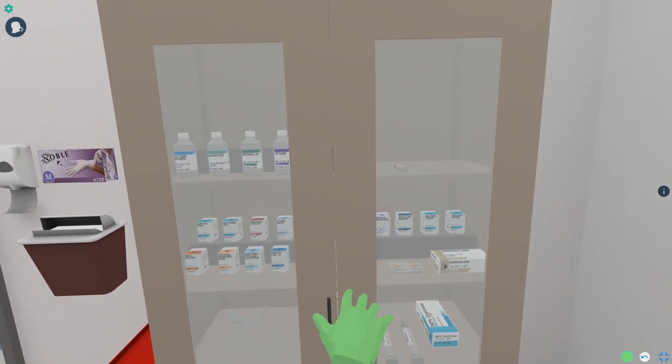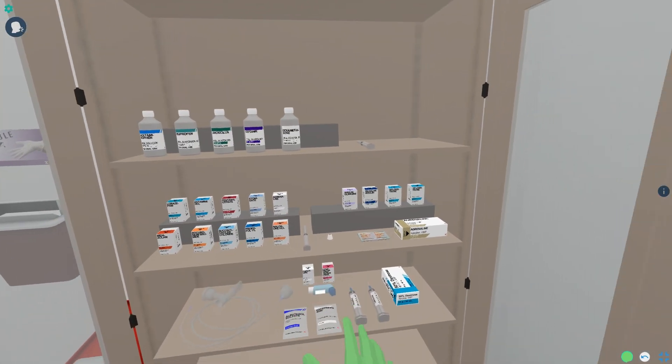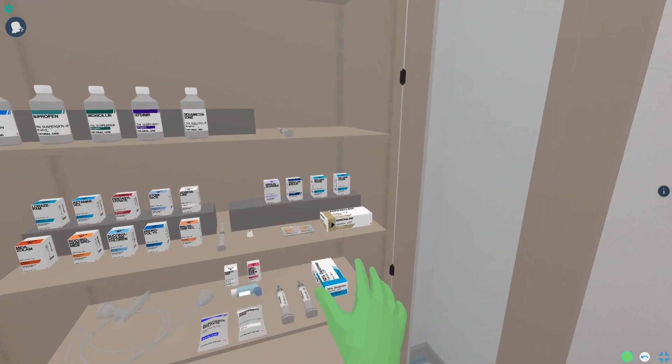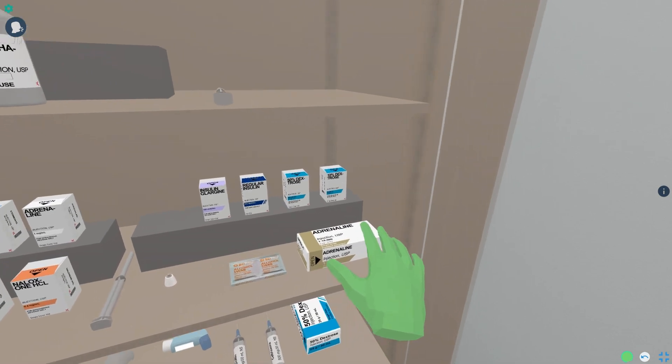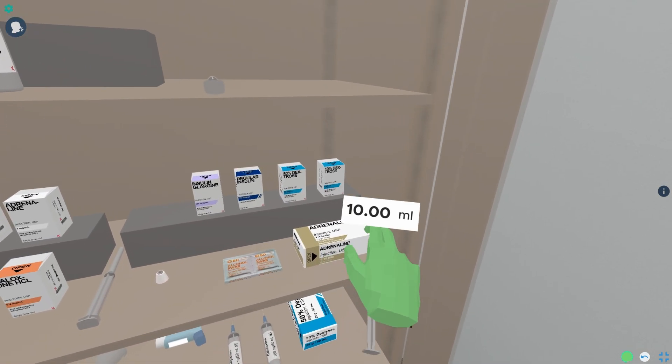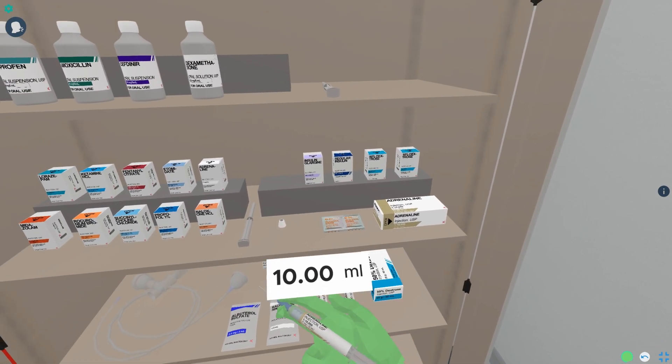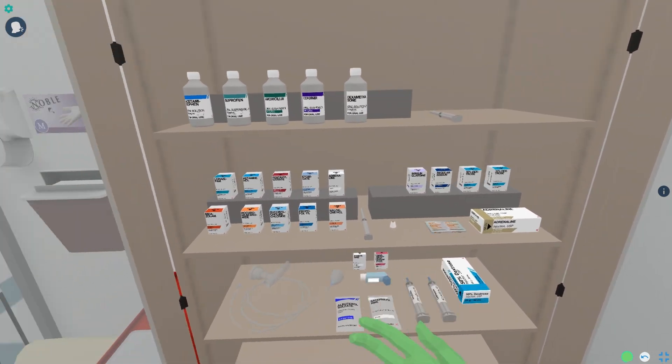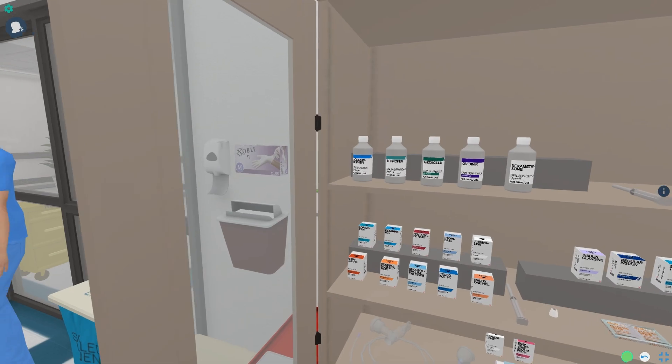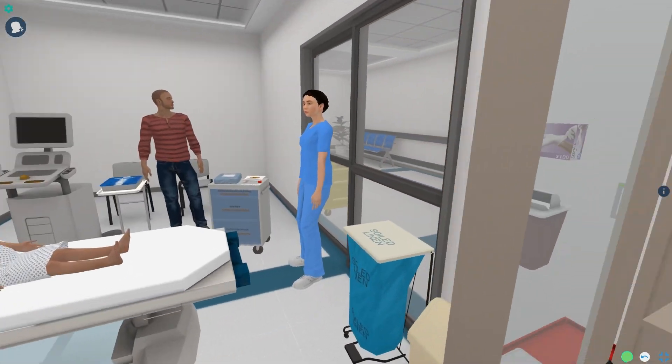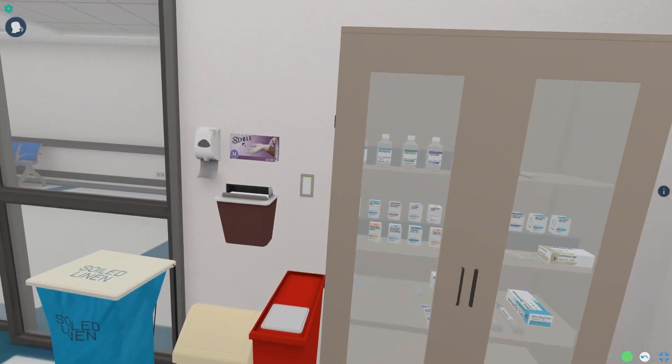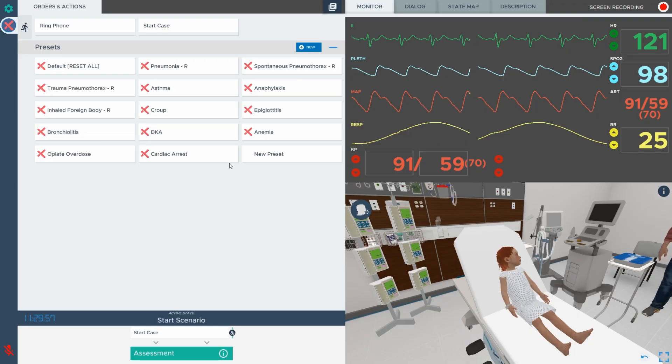The universal med cabinet allows learners to administer medications based on their clinical judgment. This open concept model simulates real-world consequences in a safe, low-stakes environment.